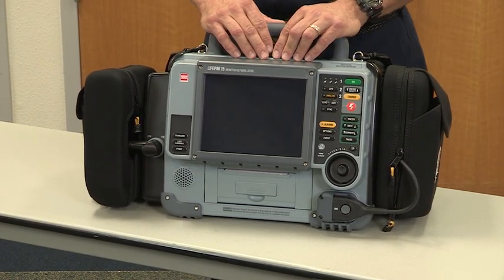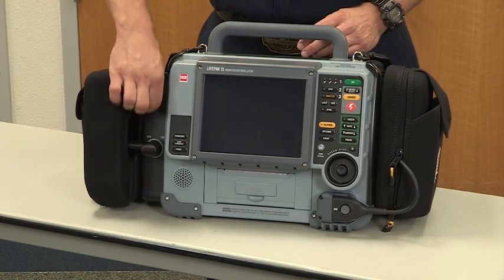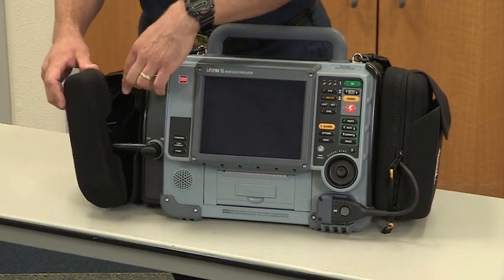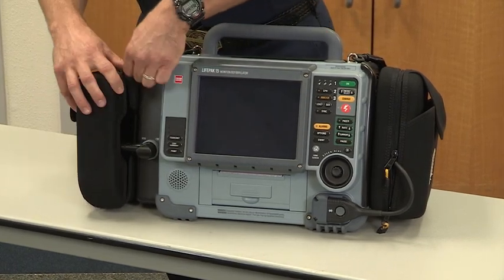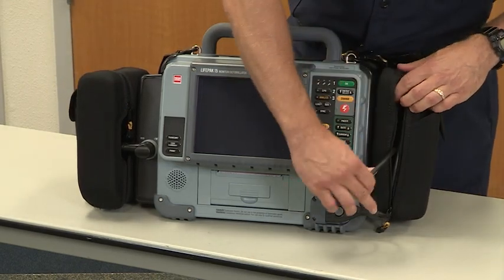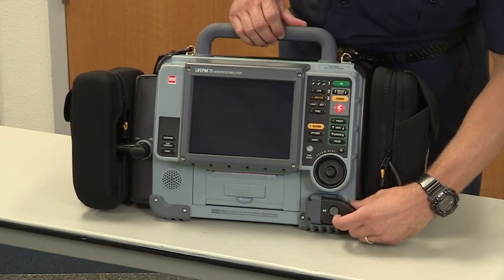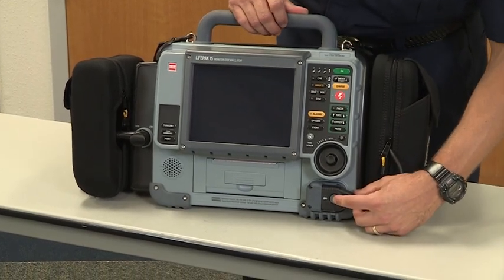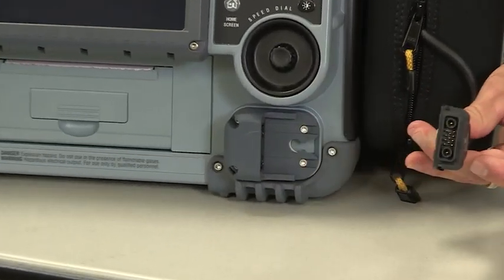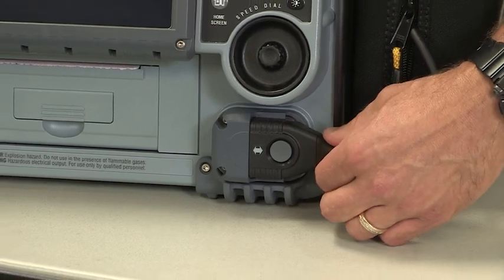The other thing we want to continue to do with LIFEPAK 15 is just do our cursory check of inventory, checking our cables, making sure that 3-lead cable is plugged in, make sure there's no damage to the cables, checking our shock cables as well, making sure there's no damage, cuts, nicks to the cable, and also being sure that it's attached. This is a little bit different from the LIFEPAK 12 in the fact that there's a push button. You just push and simply slide in and out. You should just be able to make sure that it's snug.